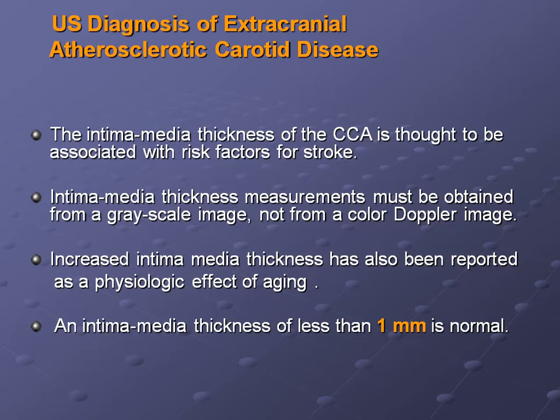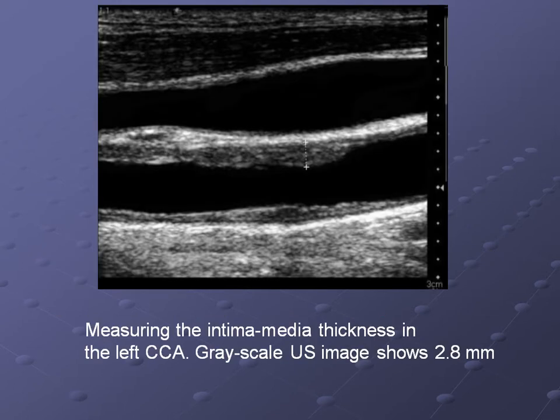If it is more, you report there is increased intimal thickness reaching up to, for example, 2 millimeter. Okay? This is the intimal thickness here. It's measured at 2.8 millimeter thickness. This is the intima. You can see this is the intima and it slightly thickens here.